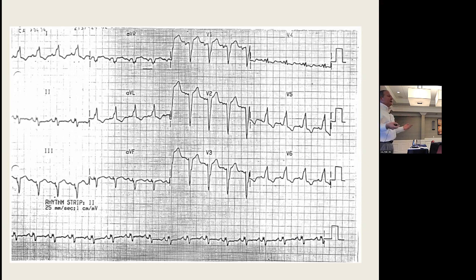And the third is the old rule of aging, which is just doesn't work as well as it used to. You know, idiopathic degenerative sclerosis of the pathways. And so people age and their pathways just don't work as well. So it's that differential that needs to be put in clinical context. So you're right, you wouldn't acutely do something unless they had chest pain and it's a new change in their EKG. Okay, good.